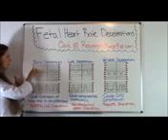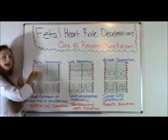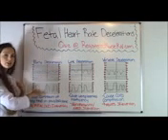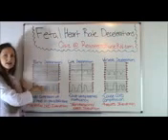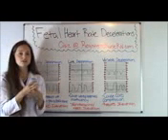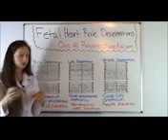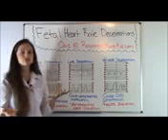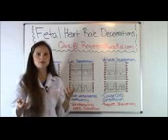You have 240, 210, 180, 150, 120, and so on. And then down here at the bottom, these are numbers measuring how strong mom's contractions are. They're measured in millimeters of mercury, and it goes all the way from 100 to 20. So it's telling us how strong those are and how the baby's heart rate is responding.